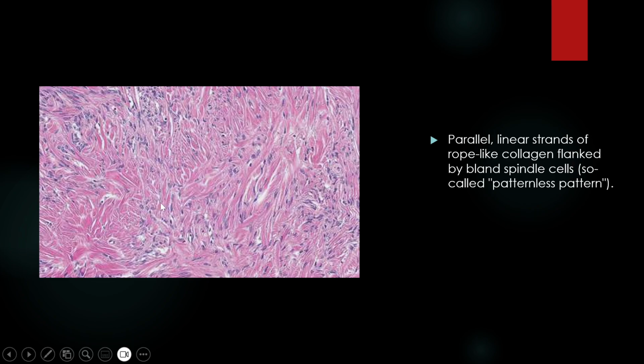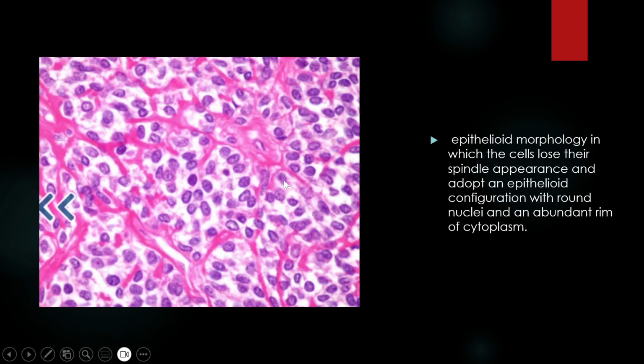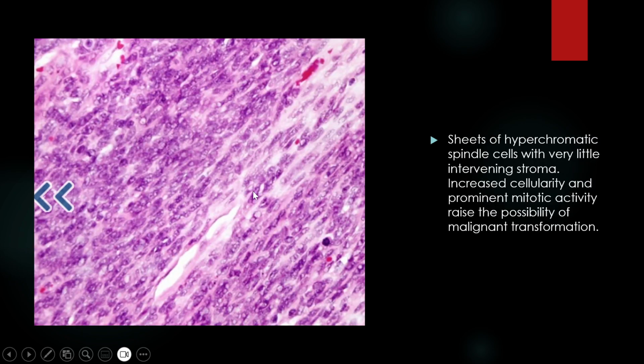They may have some sclerotic stroma. This is epithelioid variant of SFT. Usually they are spindle cell neoplasm, but they have a variant of epithelioid looking. This is a malignant form of SFT, because SFT is a tumor where we're not sure about the behavior and the prognosis, but when the cell forms this hypercellular area, hyperchromatic, mitosis, you may think about malignant SFT.